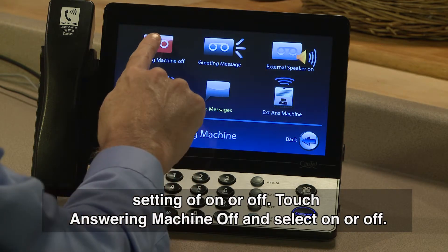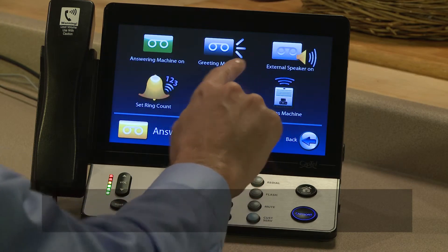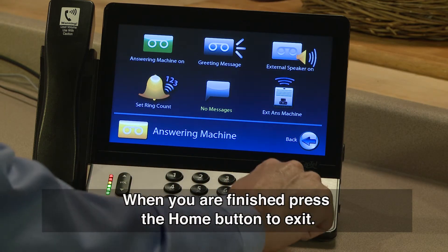Touch Answering Machine Off and select On or Off. When you are finished, press the Home button to exit.